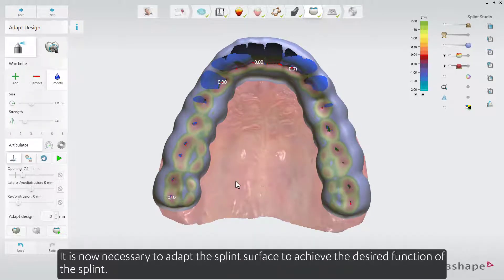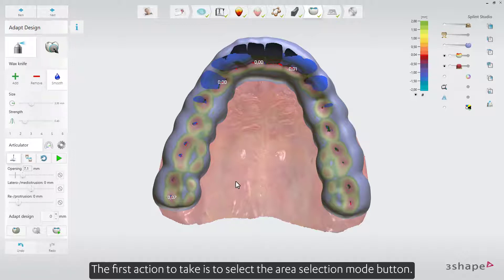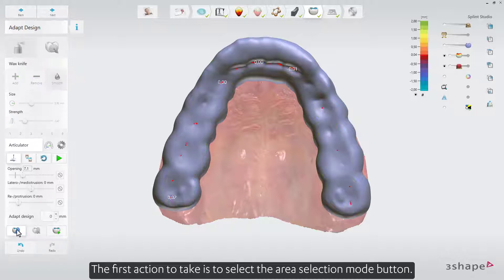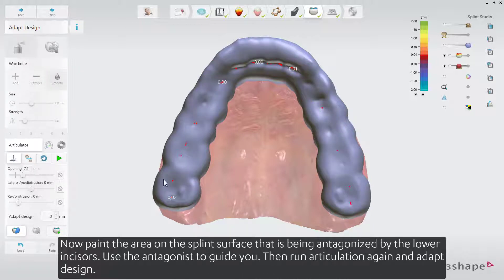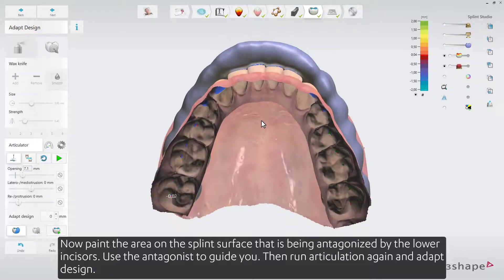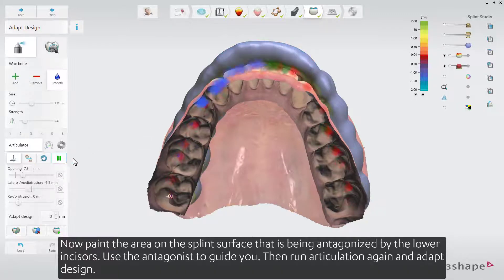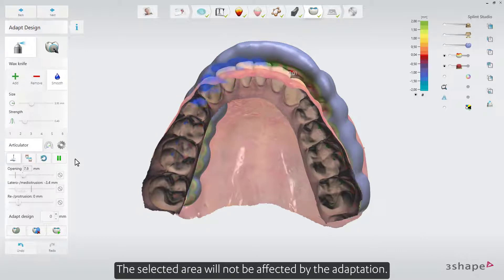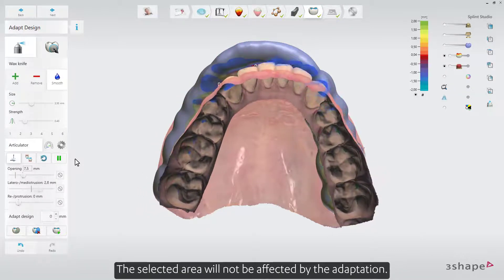It is now necessary to adapt the splint surface to achieve the desired function of the splint. The first action to take is to select the Area Selection Mode button. Now paint the area on the splint surface that is being antagonized by the lower incisors, using the antagonist to guide you. Then run Articulation again, and Adapt Design. The selected area will not be affected by the adaptation.